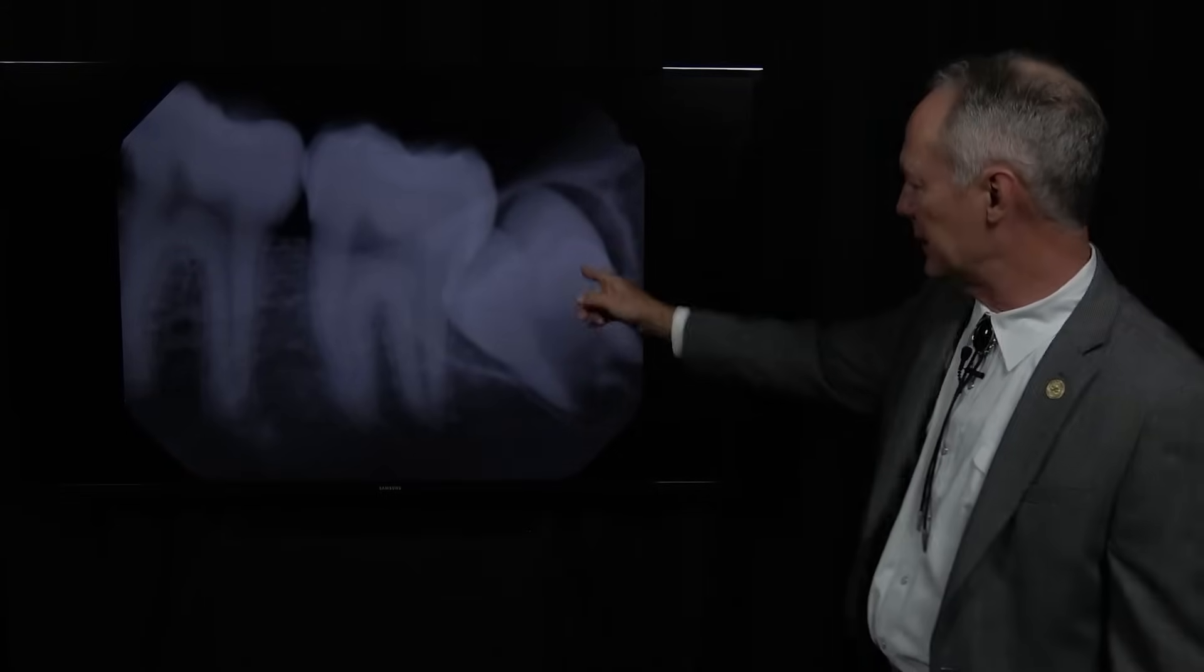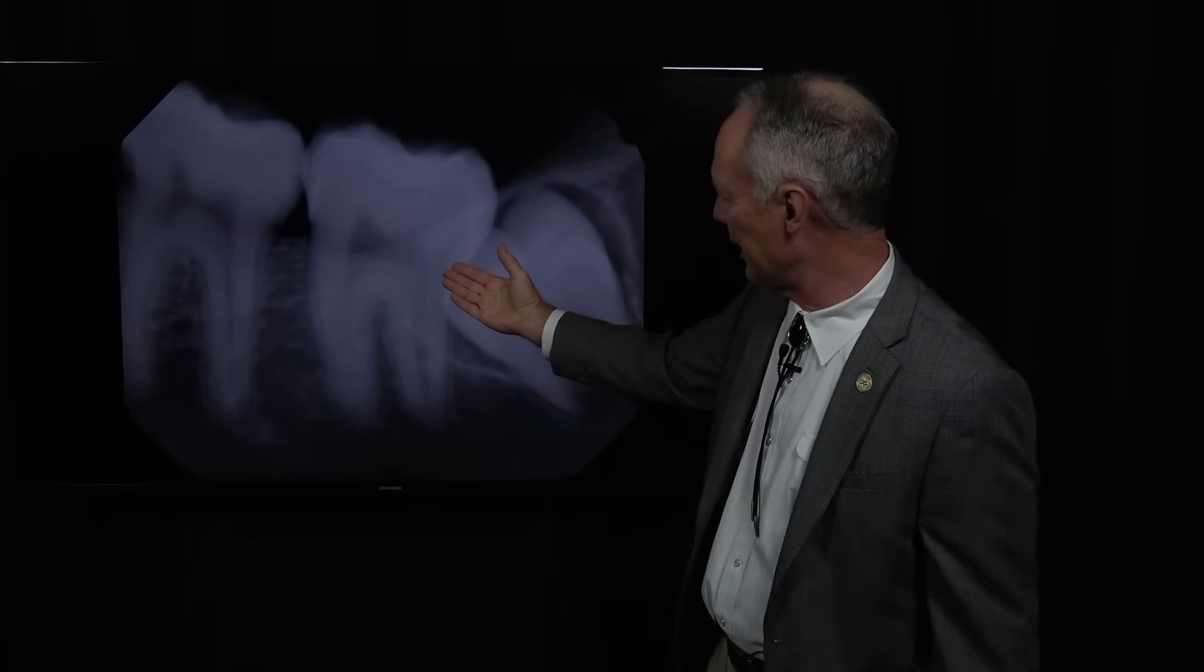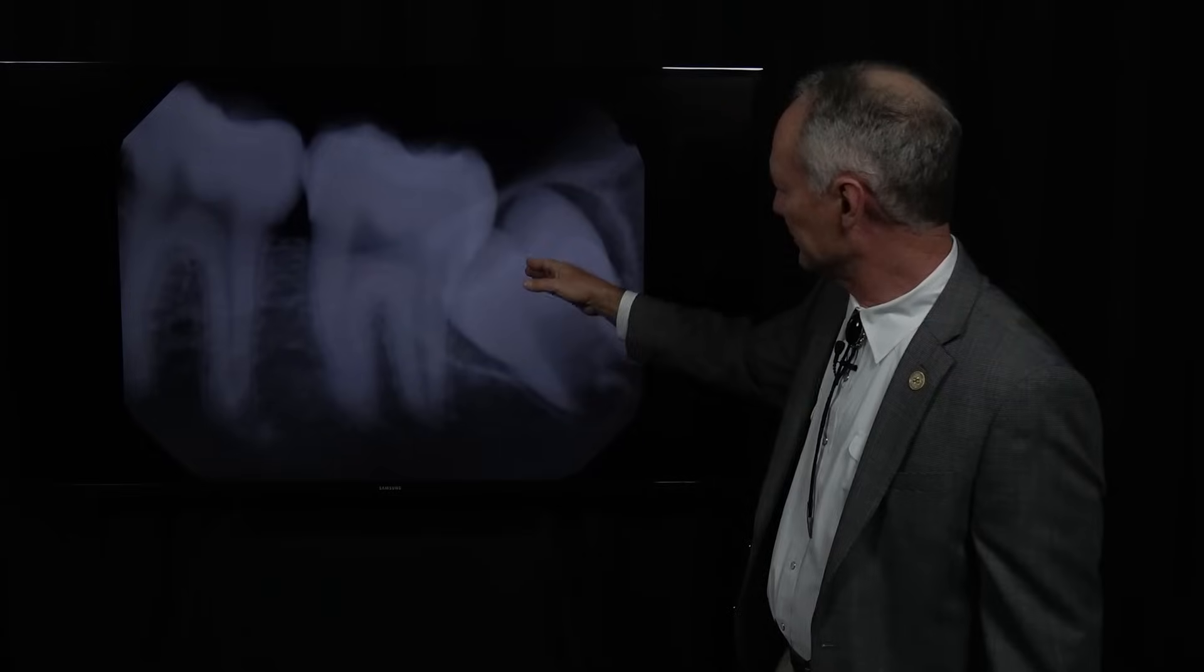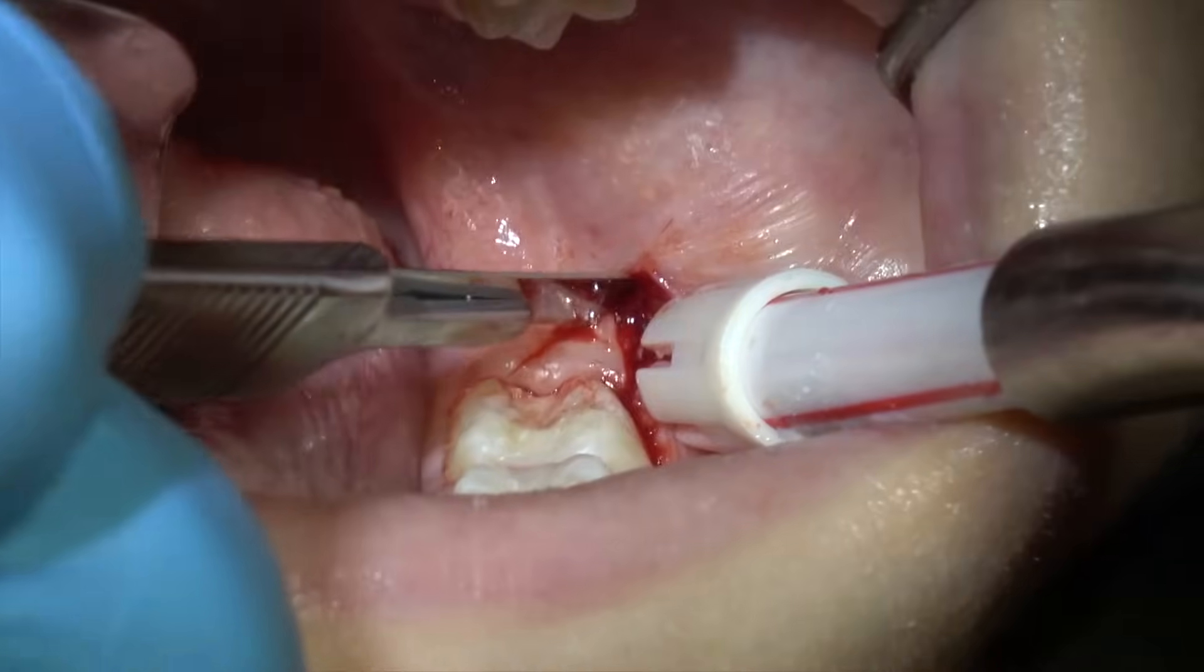Horizontal impactions look difficult, but this is harder to me because it's wedged in here behind this tooth and the cut angle is more difficult, or the angle of your cut.